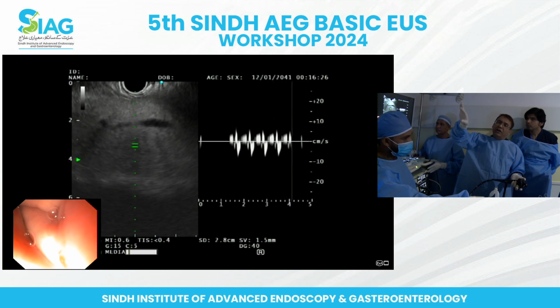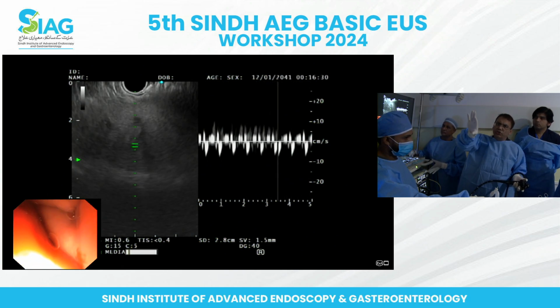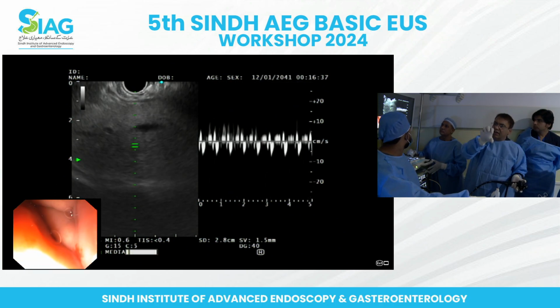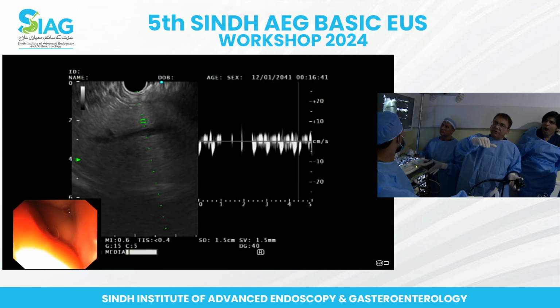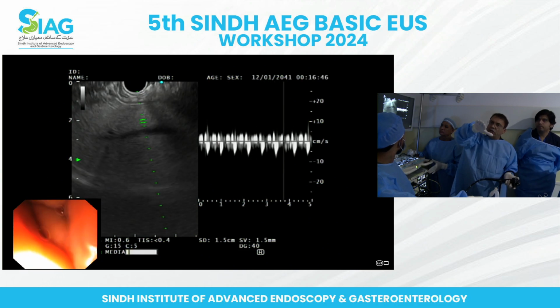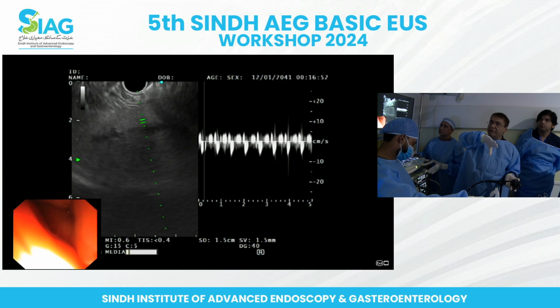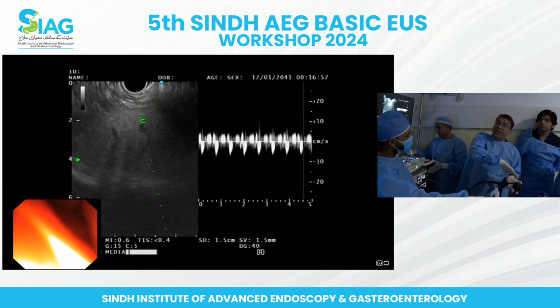So if we are talking about a transgastric approach or rendezvous, what do we do? If you have to do a rendezvous, you probably want to find an area of ductal dilation in segment 2. If you have to do a hepatogastrostomy, then segment 3. The reason is that segment 2 is very close to the GE junction, and for a rendezvous, your needle would go straight into segment 2 of the liver, and your wire trajectory would also be straight downwards.